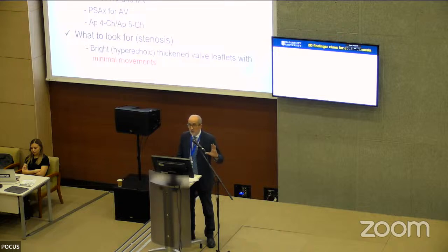Stenosis: we look at the two-dimensional imaging. Quantification is not done with the POCUS assessment. Quantification should be done by high-end echo. This is not the right place, but with the 2D images, we can look for bright and thickened valve leaflets with minimal movement of the leaflet.